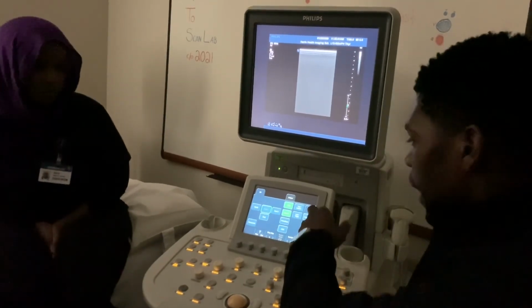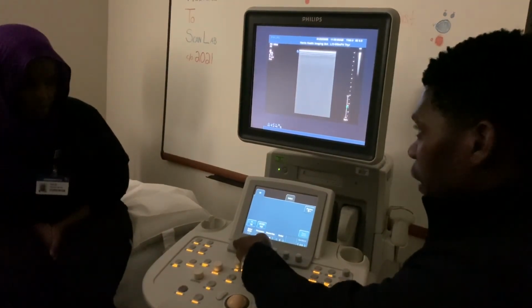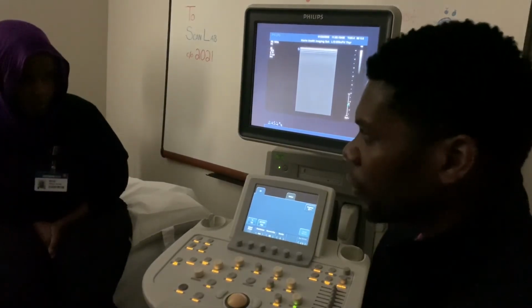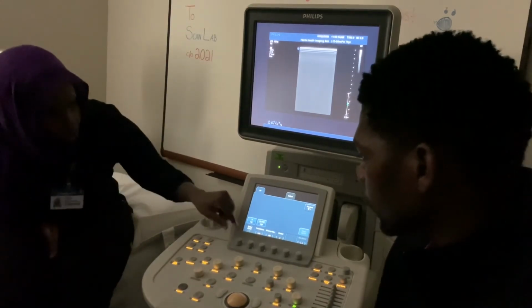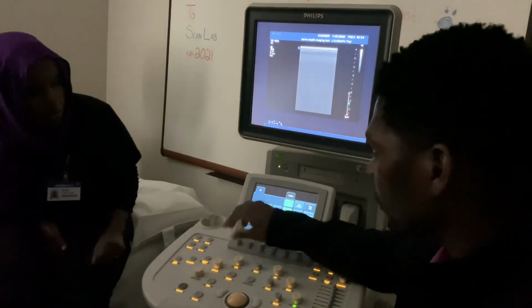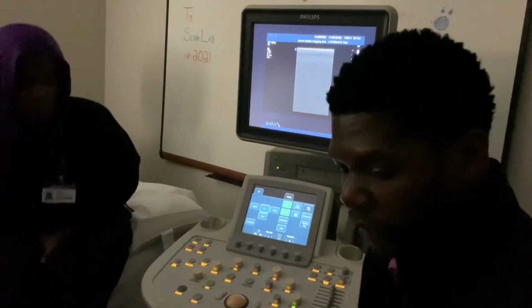Again, you hit next from the home screen. The transducer output power is right there. On that machine over there, it's right on the top left. What does it say? Acoustic power. Acoustic power. Okay? But it's not going to work without pressing next. You can't just use this by itself, because it's a dual function button. It doesn't have a function on the first screen. So that's all I wanted, guys.